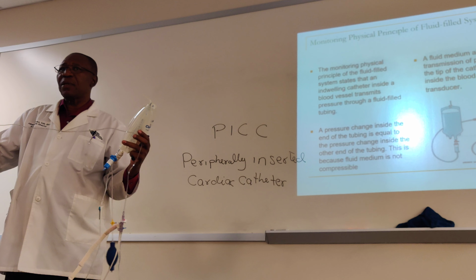Okay, so this is a fluid filled tubing. So once you get the catheter in, like I said, this portion here hooks up to the end of the catheter that is sticking out from the blood vessel.